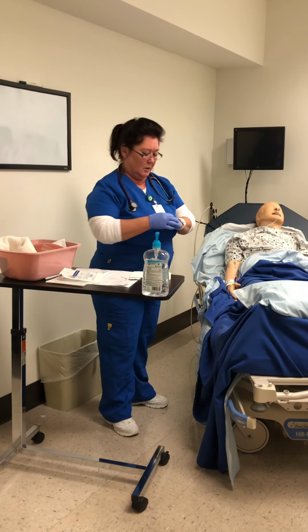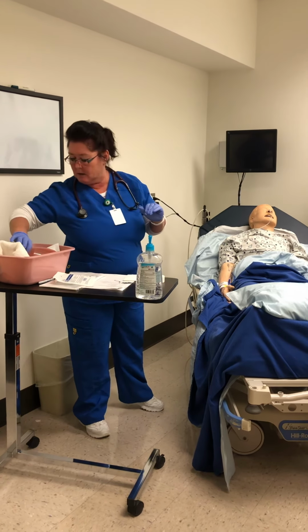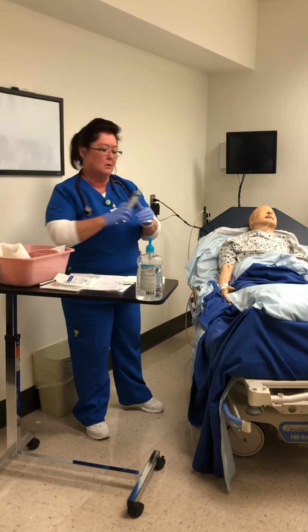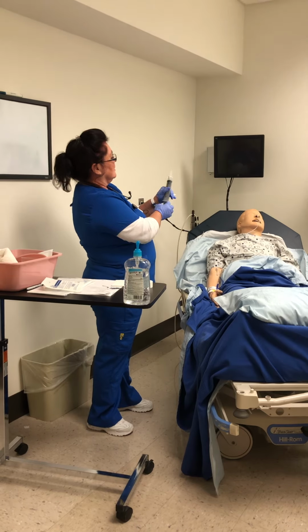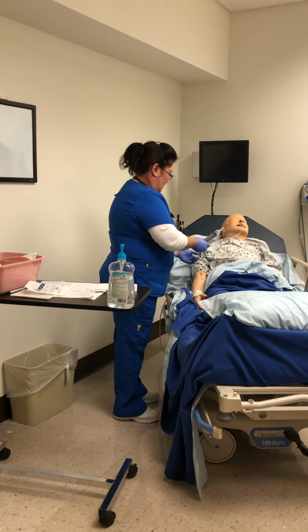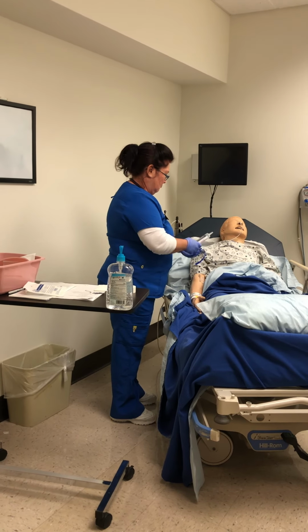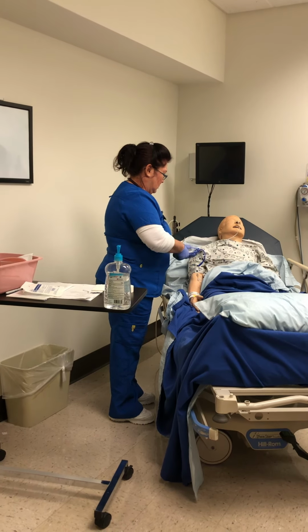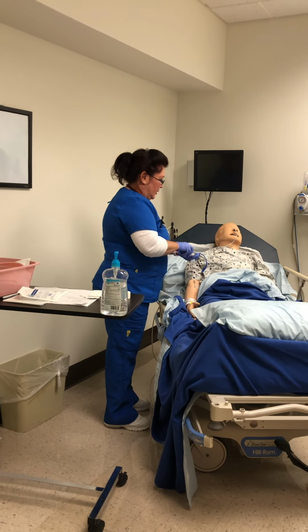And I am going to, before we pull that out, I'm going to draw back 10 milliliters of air, and we are going to make sure that there's no gastric juices in the tube. Clearing the tube.